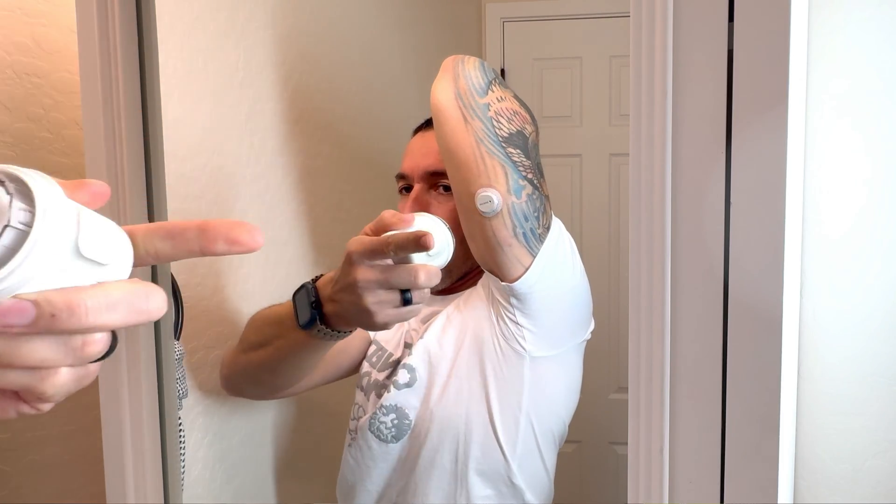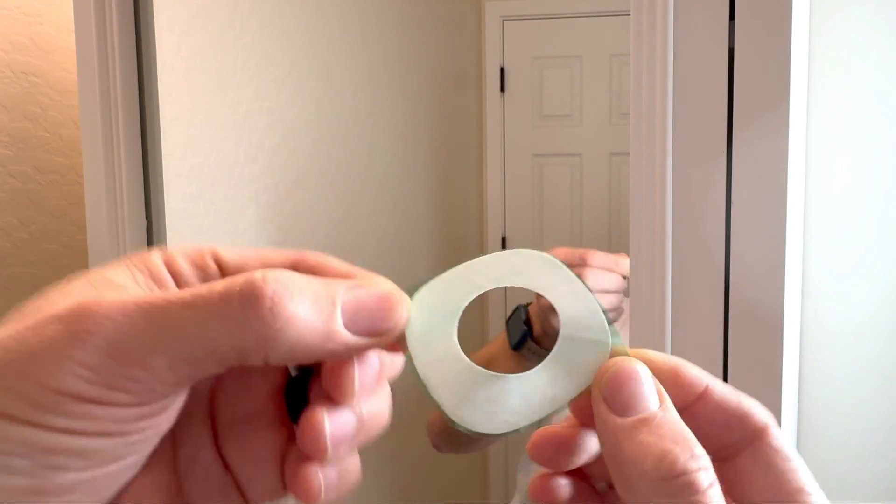Welcome and congratulations on getting the Dexcom G7 continuous glucose monitor. Today I want to walk you through setting up this CGM. I'll walk you through the insertion process and we'll talk about what the overpatch is and how to properly apply it. Then we'll wrap it all up by showing you an exciting discovery I made about the Bluetooth triangle.